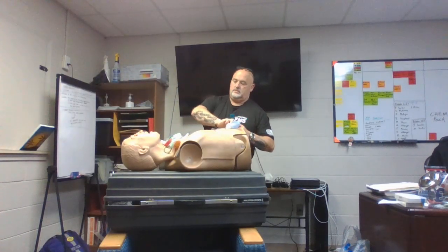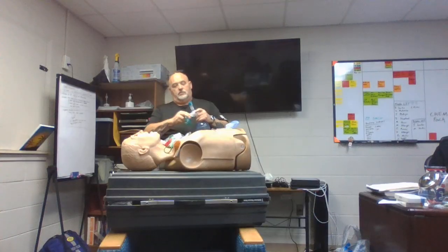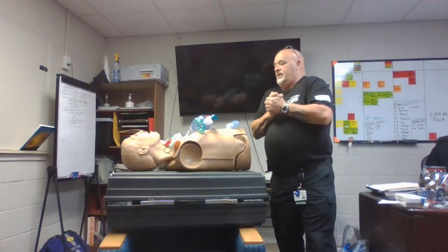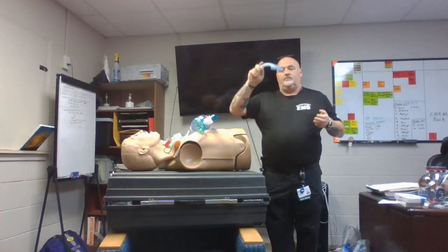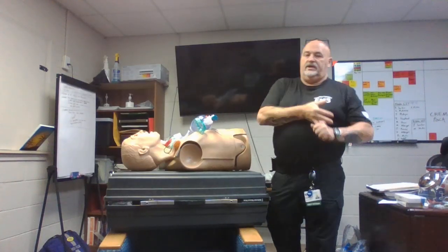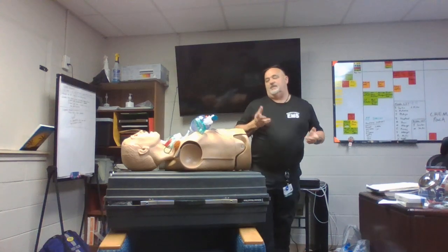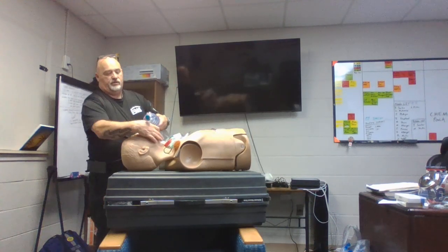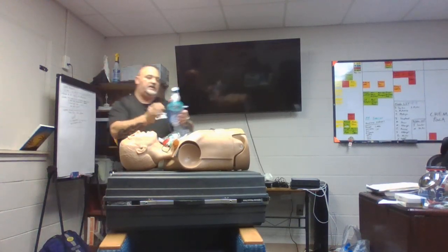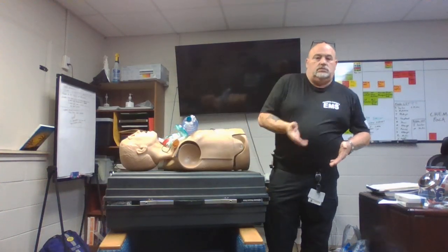What we're going to talk more about is this basic airway management without the BIAD. You can do this basic airway management without these, right? So the NPAs, the OPAs, once you get them in, you just bag, right? You can take that bag valve mask. It just shows you when to go, whether it's an NPA or an OPA, and ventilate. All right, that's what it's there for. It's designed to let the air pass through it, in and out.